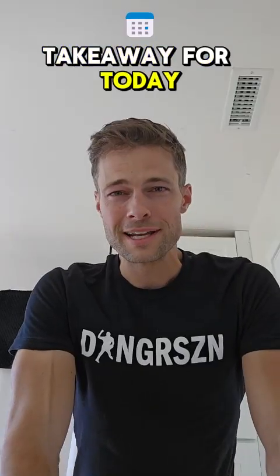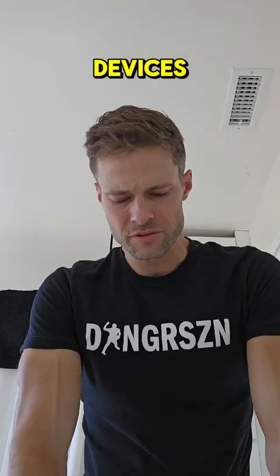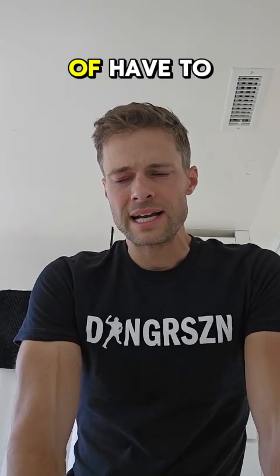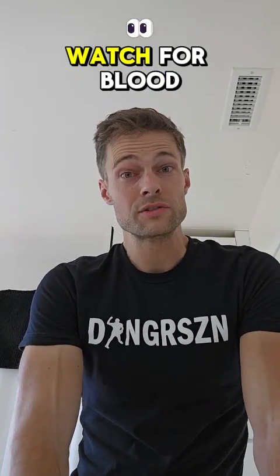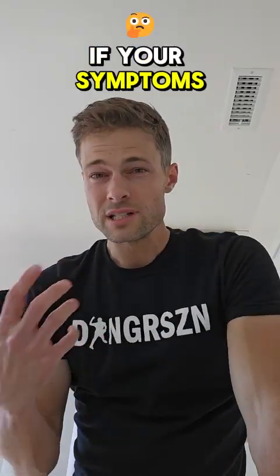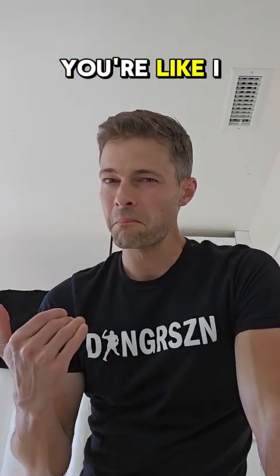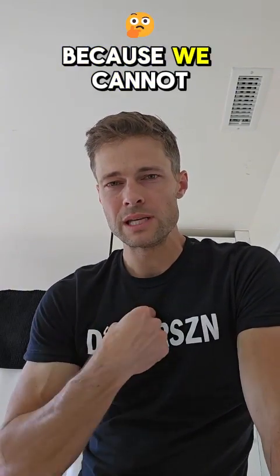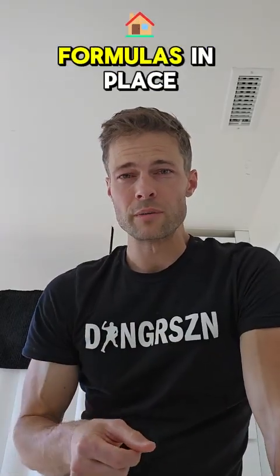So takeaway for today, if you're gonna have some nerves around your pumps, your devices, that's fine. It's pretty normal. I had those feelings too, but you kind of have to just make a decision to trust them, and then watch for the anomalies. Watch for blood sugars that don't make sense. And as these companies will tell you, if your symptoms don't match the number, double check, right? So if it says you're low and you're like, I feel fine, just do a quick finger stick and double check, because we can outperform any algorithm, assuming you have the right knowledge and blood sugar formulas in place.